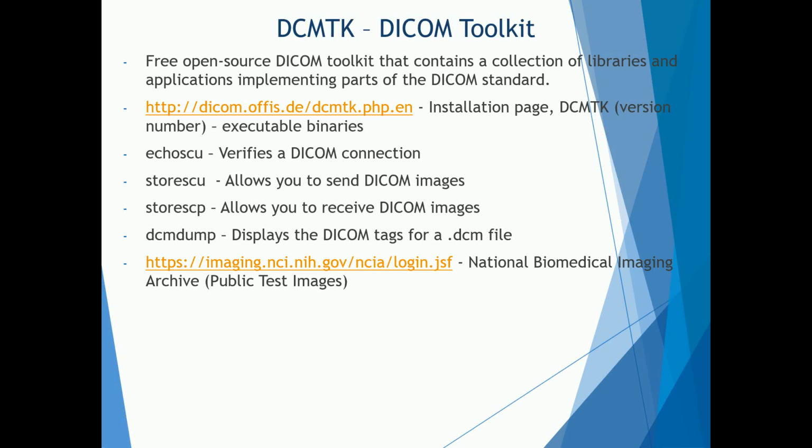Next, I'd like to talk about the DICOM Toolkit. It's a free open source DICOM Toolkit. Well, it's actually called DCMTK. DCMTK is a free open source DICOM Toolkit that contains a collection of libraries and applications for implementing parts of the DICOM standard.